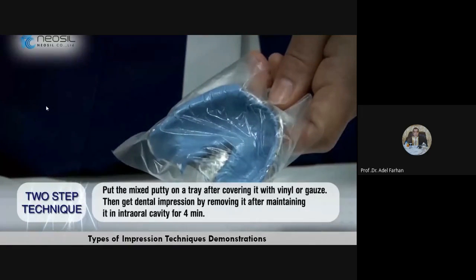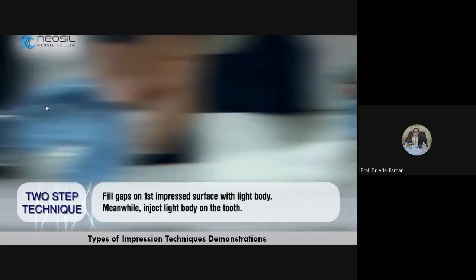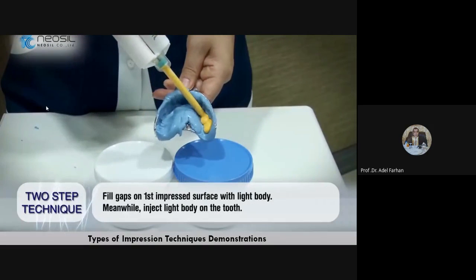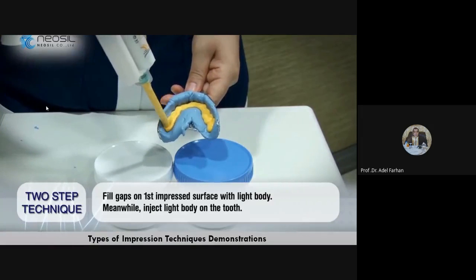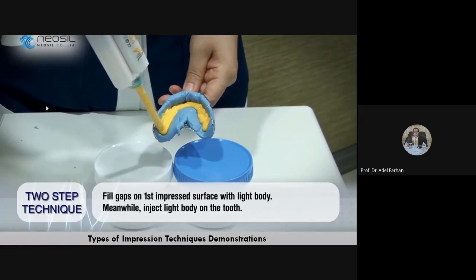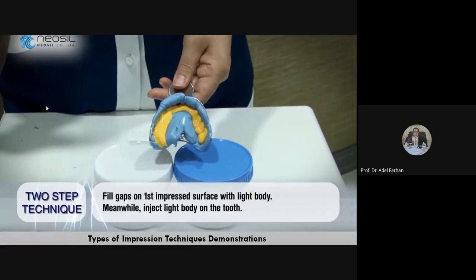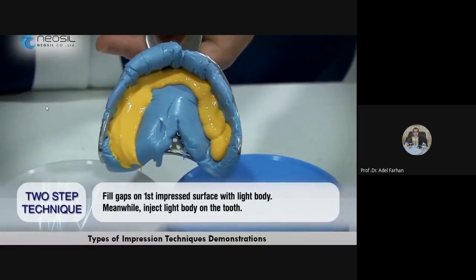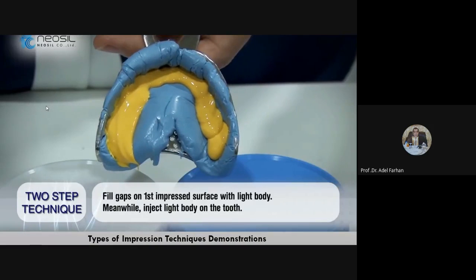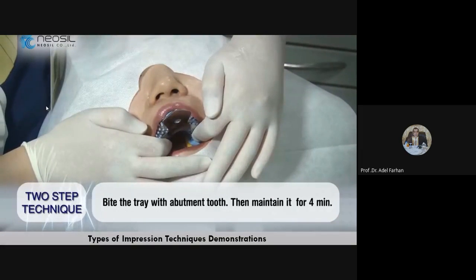طبعا بوجود هاي الطبقه مال النايلون راح ناخذ هذه الطبقه مال النايلون. شنو فائدتها؟ بعد ما ناخذ الامبريشن راح تعطينا سبيس. اوكي اخذنا امبريشن أعطتنا سبيس، واخذنا النايلون أعطتنا سبيس للايت. اللايت بادي مثل ما قلنا part of it inside the patient mouth والباقي بالتري، and you reseat it.